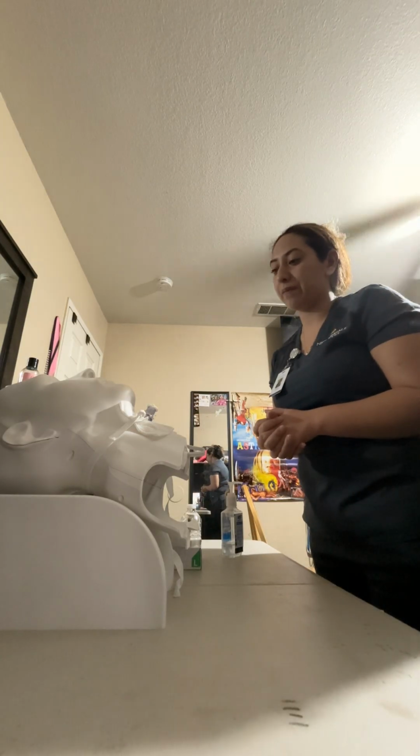Hi Alfredo, I just want to let you know that I have received orders to clean and change your trach dressings and trach ties. Do you have any questions for me? So my patient at this time has indicated that they have no questions. I am going to put some gloves on and set up.